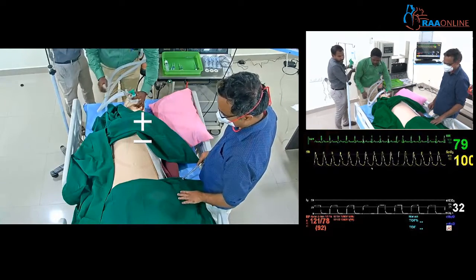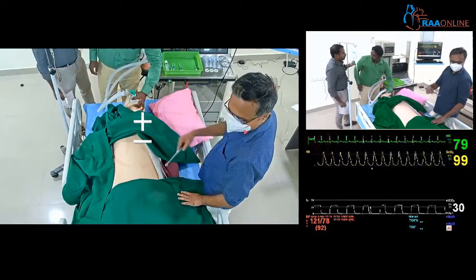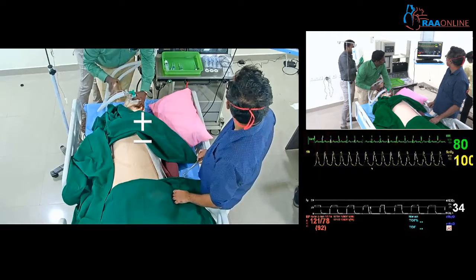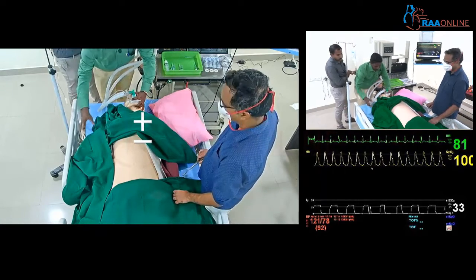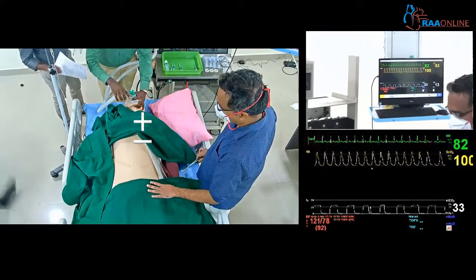Vecuronium 0.1 mg per kg. Okay, sir. It is given. Yes, sir. Please keep the suction connected. Okay. Vitals are stable. Saturation is okay. Okay, sir. Given, and 3 minutes over. Yes, sir. You have given 3 minutes of pre-oxygenation with normal tidal volume ventilation. Okay, sir. So now you will intubate the patient.